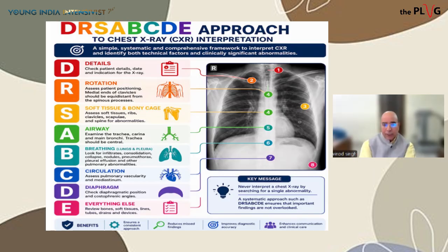And this approach has been shown to improve the diagnostic accuracy of the chest X-ray. Also it enhances communication, because everybody who is looking at the X-ray in the ICU is talking about the same thing in the same way. That improves the communication in the intensive care unit.